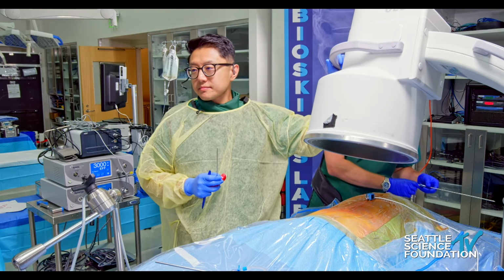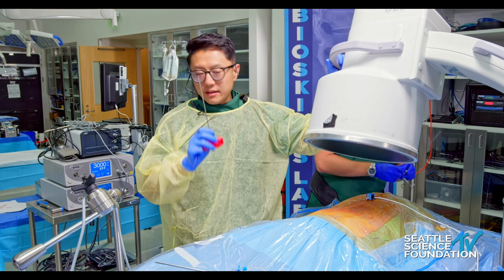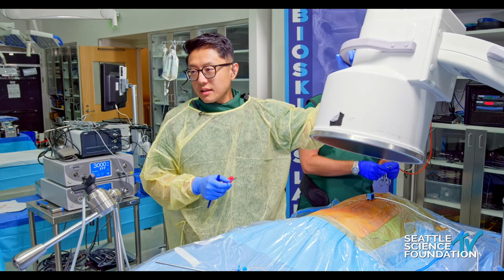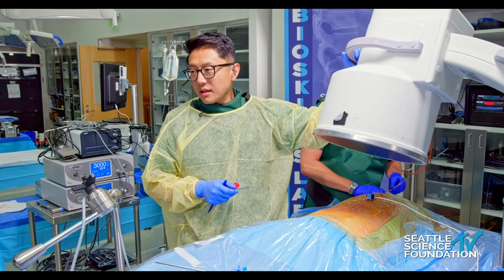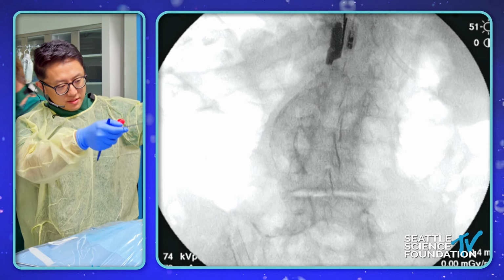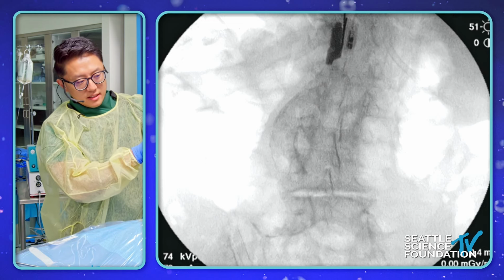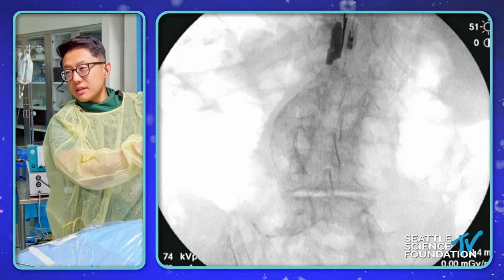Yeah. So what the audience, hopefully what you're seeing is that, in this kind of constrained setup that we have, rather than settle for a worse looking x-ray, he's really trying to line up the end plates and get a true AP view. So he's going to be doing some trigonometry in his head to figure out exactly how to make his angles work for this, which is honestly a marvel in itself. No, just the arc, yeah. Let's take one more shot there.